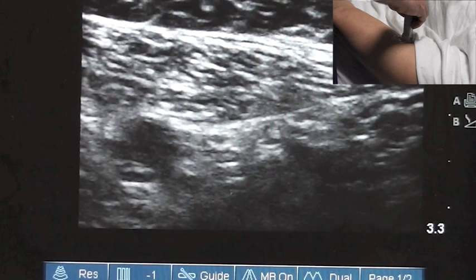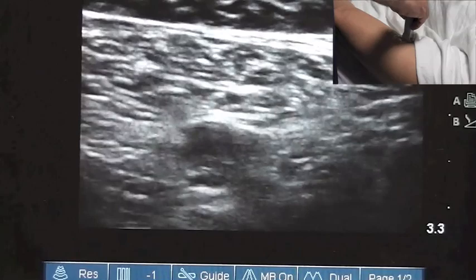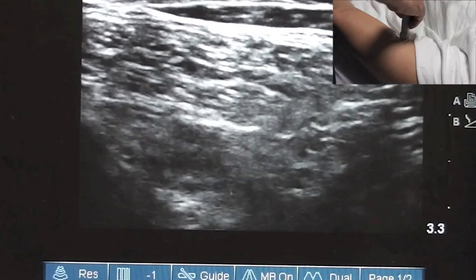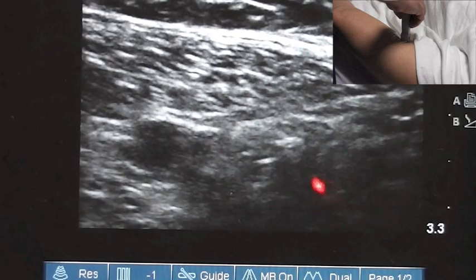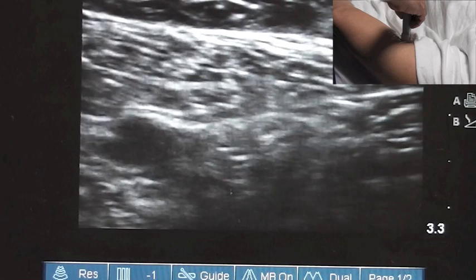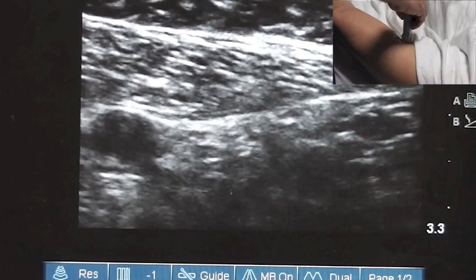We're going to be looking in this area. One thing to keep in mind is that this nerve is often difficult to see — it's quite small. What I'm going to do is scan caudad until the femoral artery dives away and disappears, then scan upward until I get it back. I'm manipulating the probe gently to show you the best possible view of the femoral artery and vein. This is the site where I usually do my block. I take note of the muscle groups — the sartorius, the vastus, and adductor groups just medially. Your target is going to be sitting just lateral to the femoral artery and vein, just underneath the fascial plane, right underneath the sartorius muscle. I would come in with my needle and do a very small injection right here.